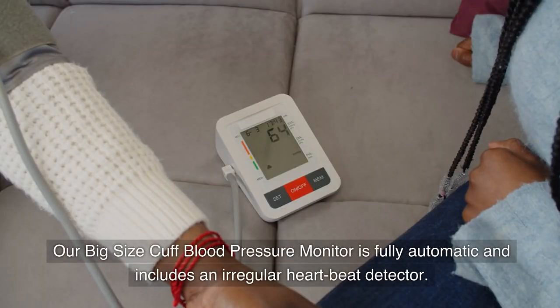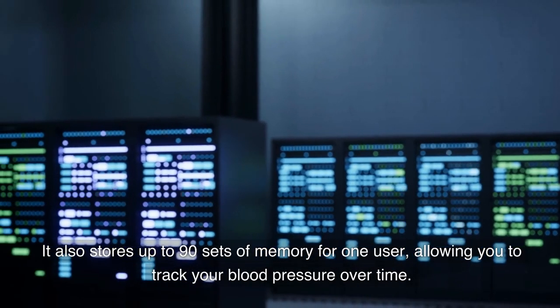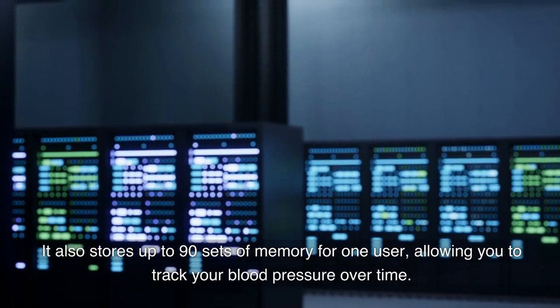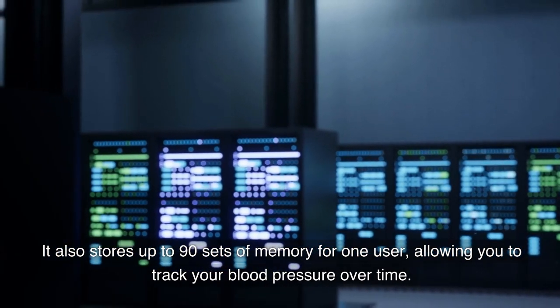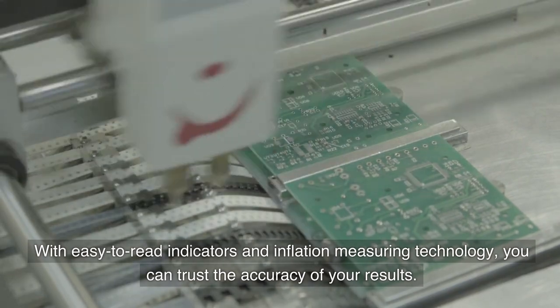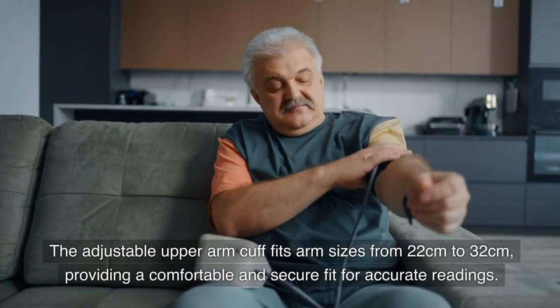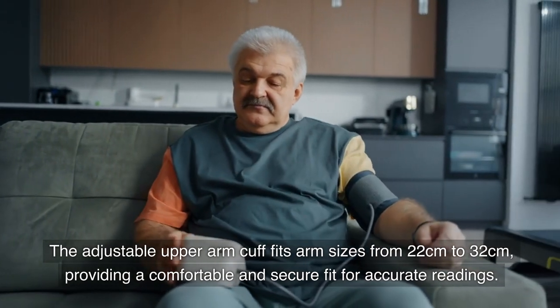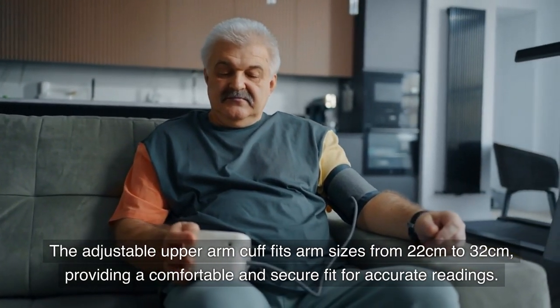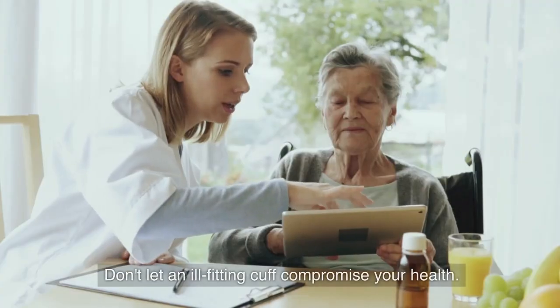Our big size cuff blood pressure monitor is fully automatic and includes an irregular heartbeat detector. It also stores up to 90 sets of memory for one user, allowing you to track your blood pressure over time. With easy-to-read indicators and inflation measuring technology, you can trust the accuracy of your results. The adjustable upper arm cuff fits arm sizes from 22 centimeters to 32 centimeters, providing a comfortable and secure fit for accurate readings.